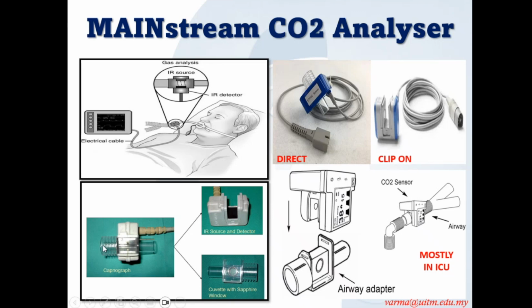You can see this one end can be connected to the patient end and another one to the circuit, whereas this is a clip-on IR source and detector. This is the adapter. So this goes into this adapter. Okay. So mainstream can be either a direct one or clip-on.